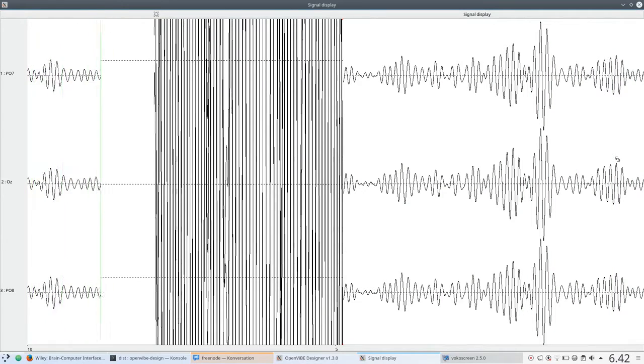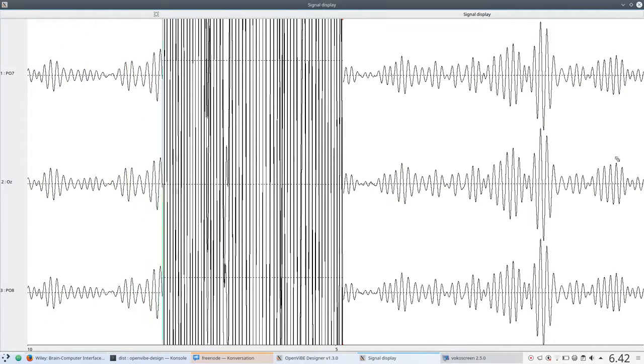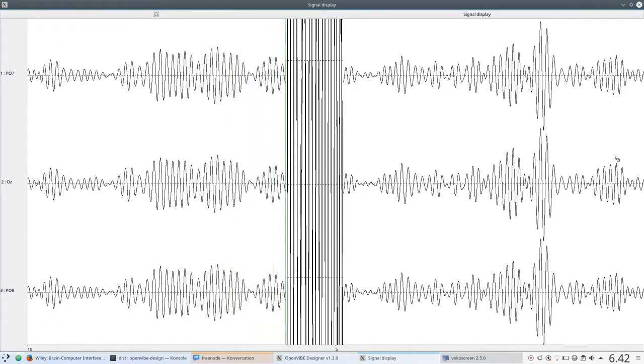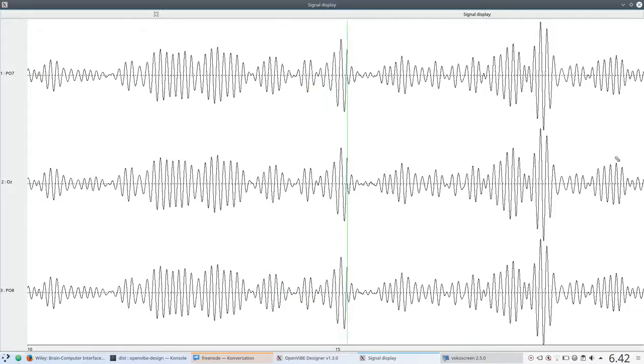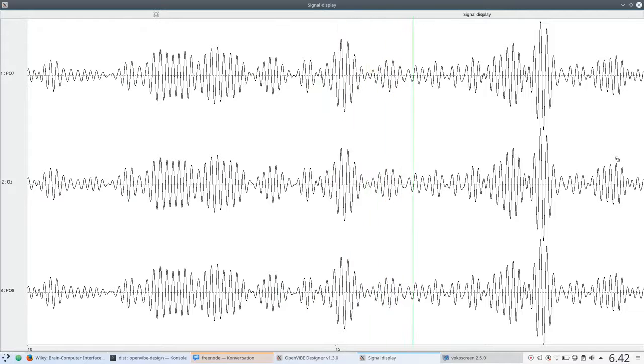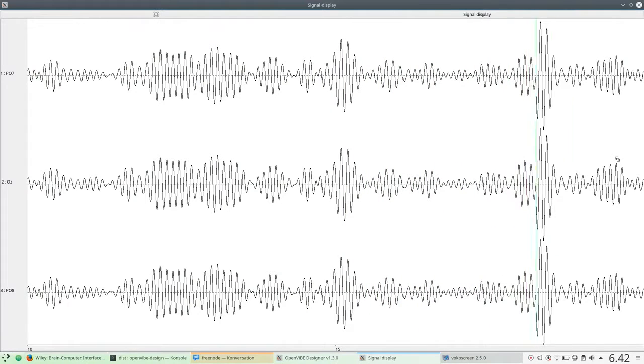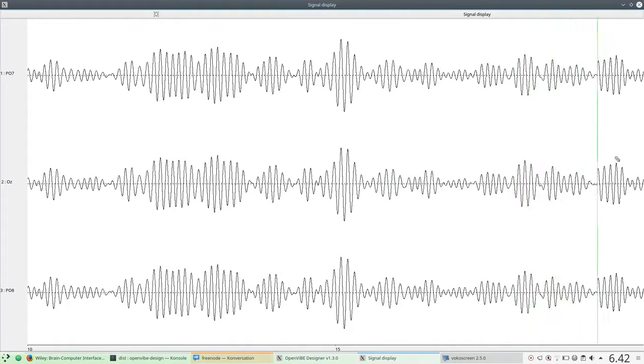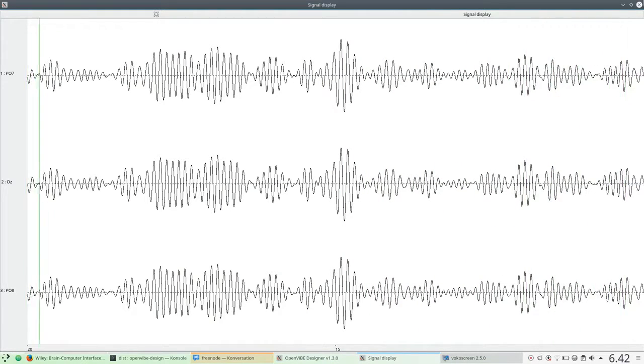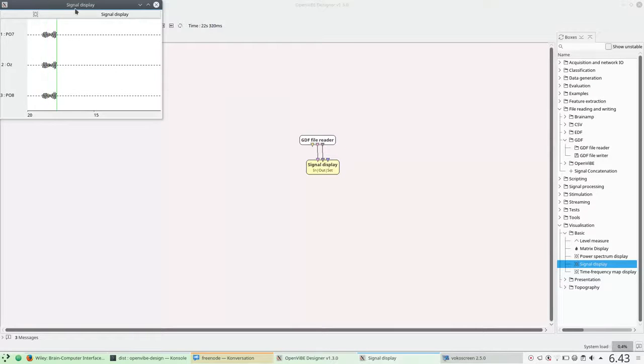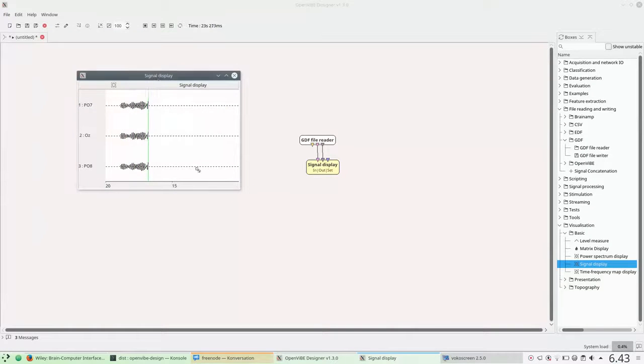This will open up the door for you to do further analyses, learning about the machine learning, signal processing, etc. But the first step was just to get some basic EEG data in and display it on the screen.